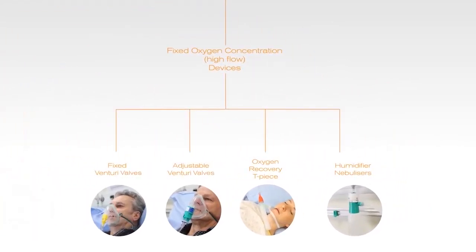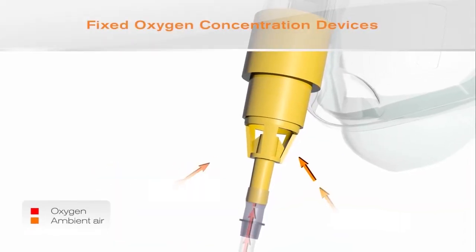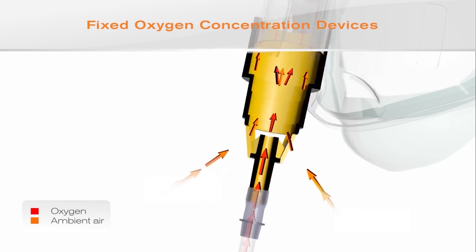Fixed oxygen concentration devices, also known as high-flow devices, deliver flows that meet the patient's total inspiratory requirements.